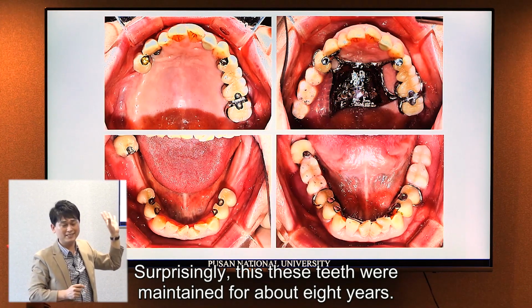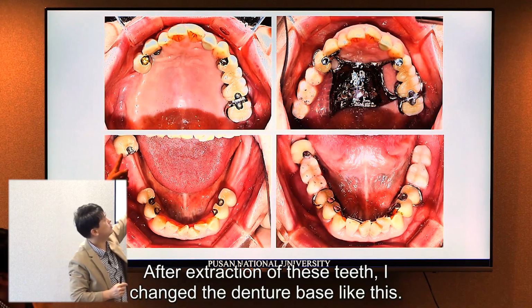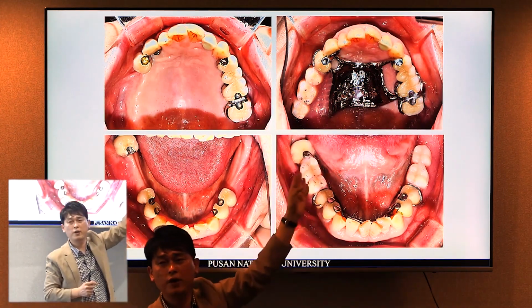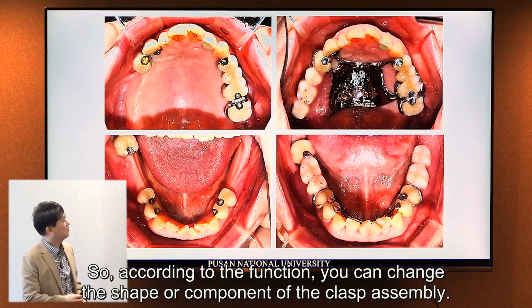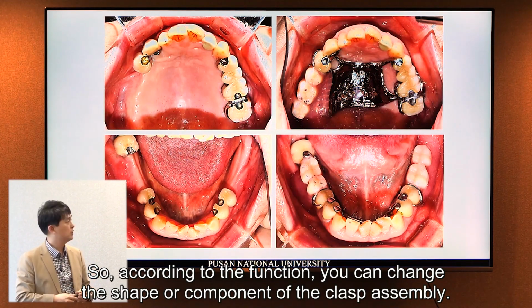Surprisingly, these teeth were maintained for about 8 years. After extracting these teeth, I changed the denture base like this. I repaired it. So according to the function, you can change the shape or components of the clasp assembly.